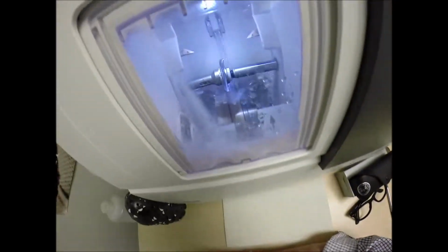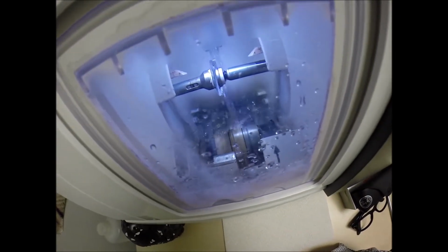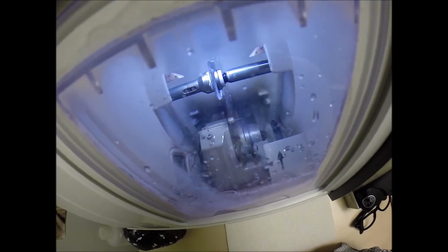Now if you see the water spraying onto the lens, it tells me it's in the last 20 seconds. In just a moment, a lever will come out. At the end of that lever is a spinning disc. That's what's going to apply the safety bevel to the rear concave surface of the lens.